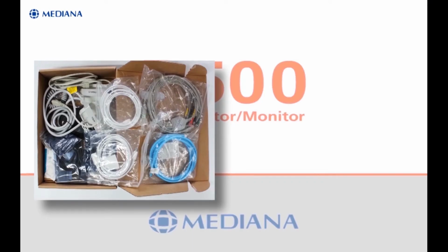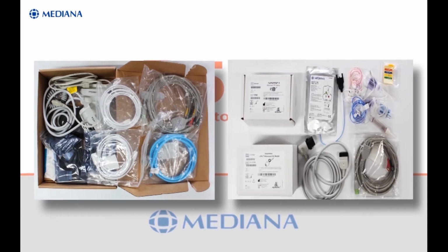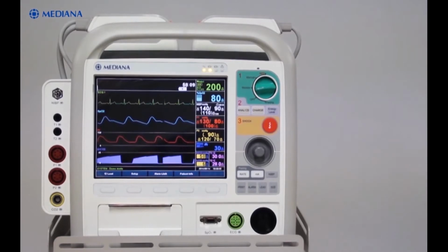The pictures are of the accessories that come with the basic configuration of D500, and depending on options, some additional accessories will be included. Before using D500, please check if all of the accessories are included, and if so, the main unit and accessories are not damaged. Let's take a look at the main unit and its components.